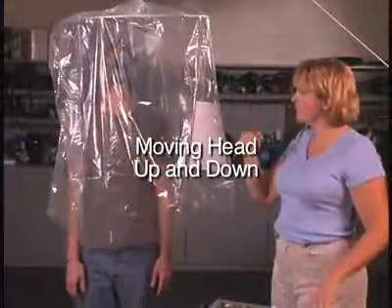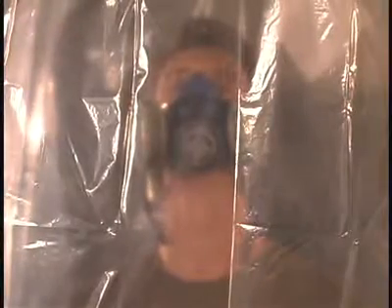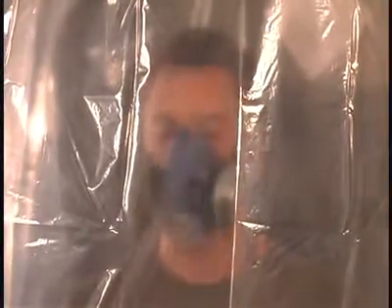Moving head up and down. Standing in place, the subject slowly moves his or her head up and down between extreme up and down positions. Hold the head in each extreme position for at least 5 seconds while inhaling. Perform at least 3 complete cycles. Do not bump the respirator on the chest.